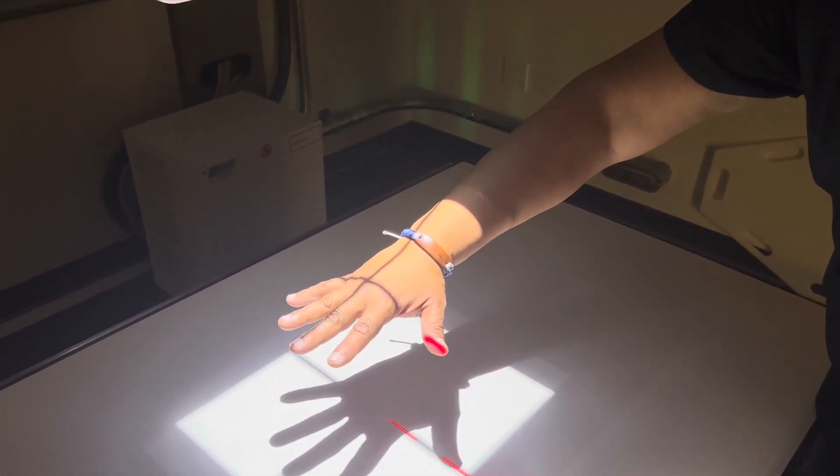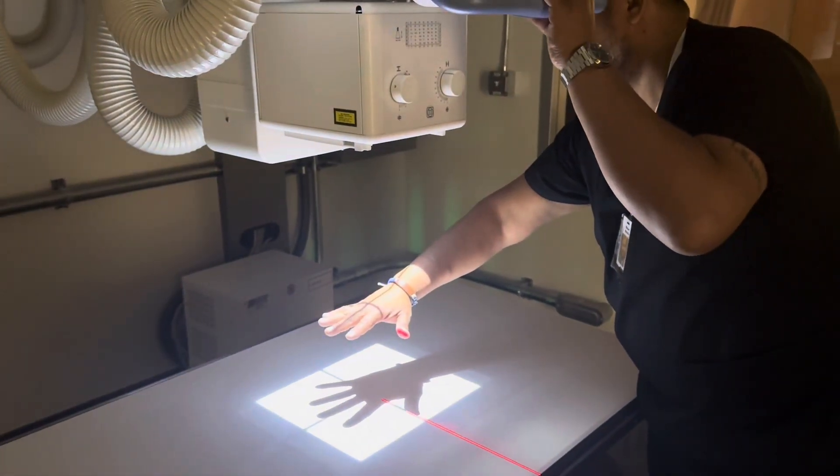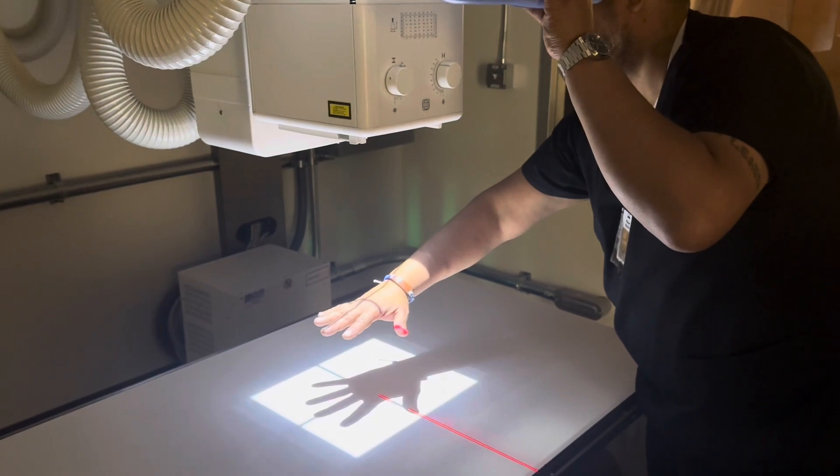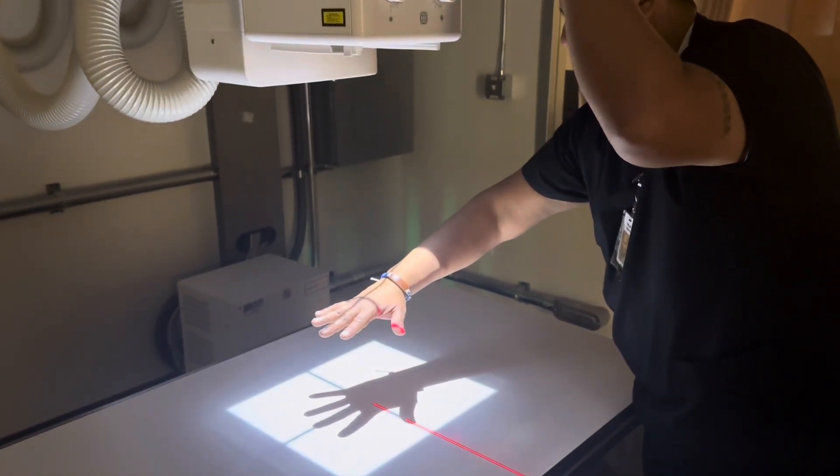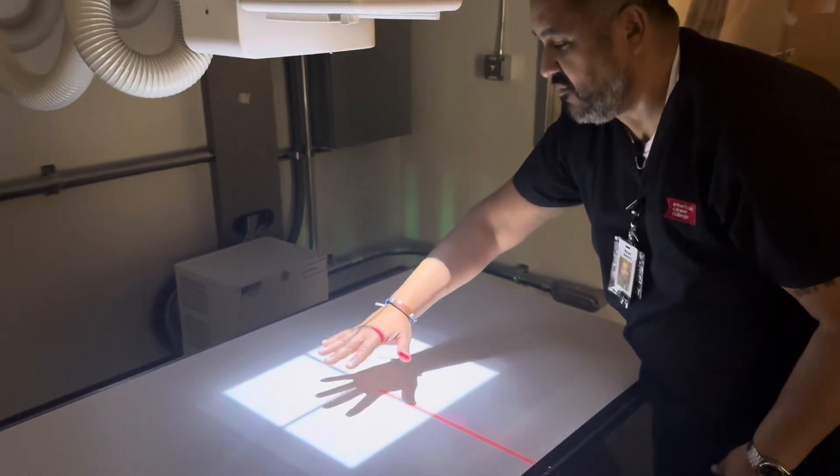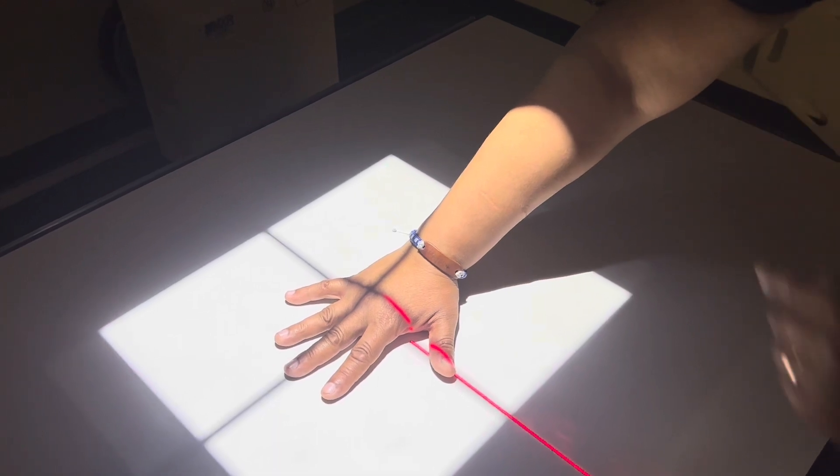Now watch if you bring the SID down, I don't know if you guys could see this but the shadow around my fingers is getting larger. So when you bring down the SID you're going to get more magnification. So you always want to try to increase your SID we said and bring down your OID as much as possible.